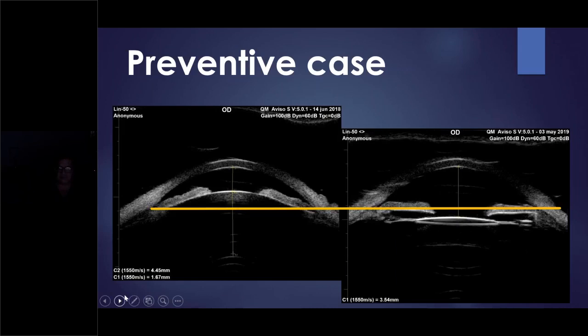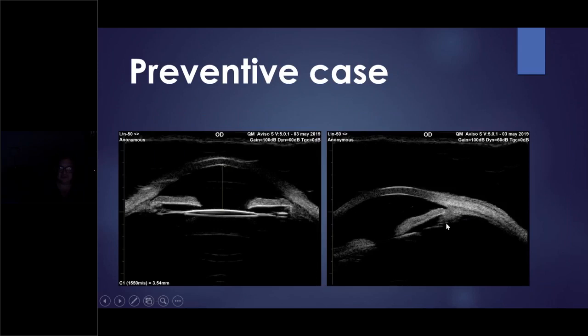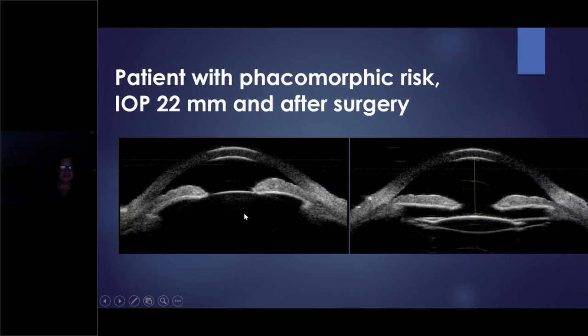Okay, then, look before and look after the surgery. The risk is very low. She solves this refractive situation, and is very happy. Her sister came with the same case, but even more closed. We made the same operation. And we released the angle closure, and we made the solution of this.